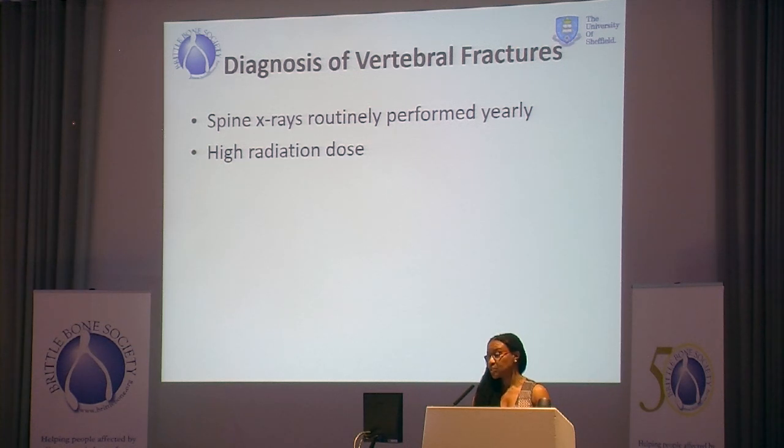Although there's that limitation, these spine radiographs are what we do routinely. It's been the standard, and children with OI will have an annual chest spine radiograph, lateral spine, in addition to their DEXAs.